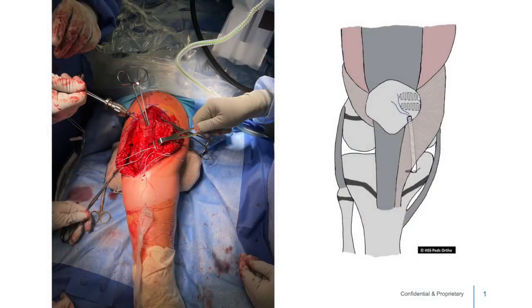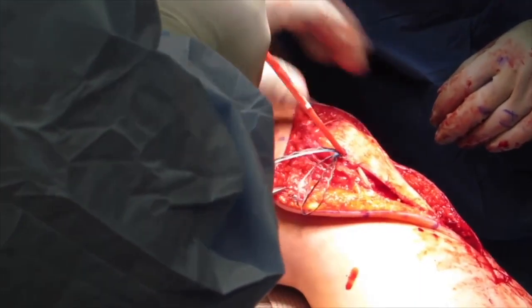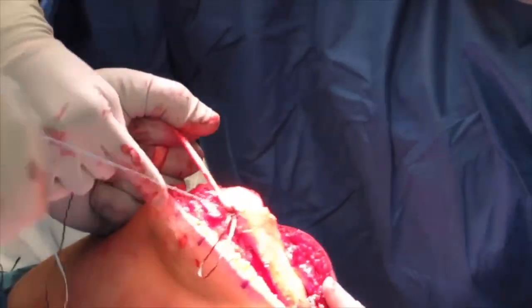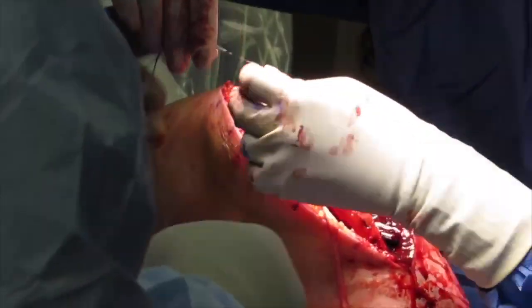Similar steps are then repeated for the patella, and a 1.8 millimeter Arthrex knotless FiberTech anchor is placed at its inframedial aspect. The free end of the graft is then placed through the patellar FiberTech and secured in approximately 60 degrees of knee flexion to ensure appropriate residual patellar mobility without over-constraining patellar motion.